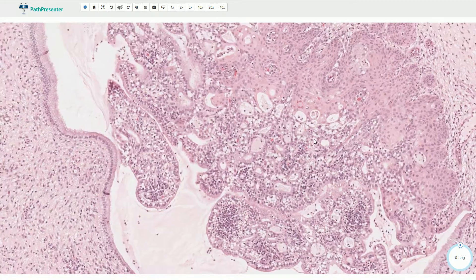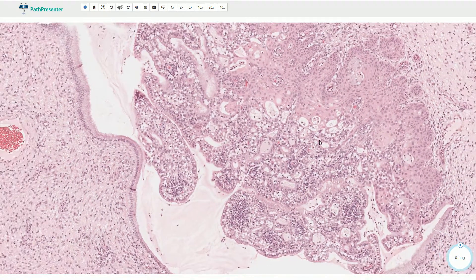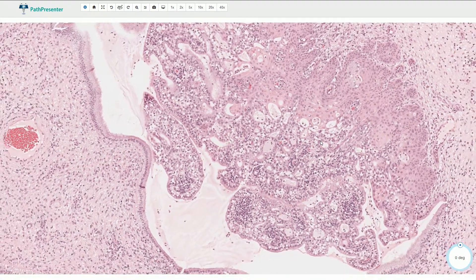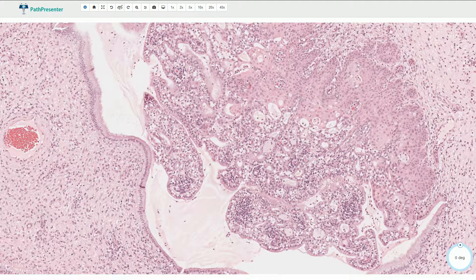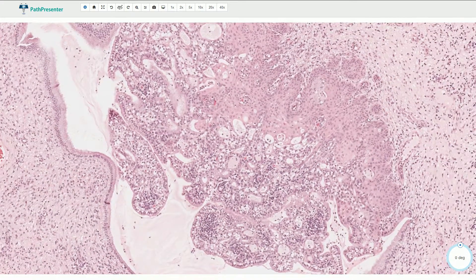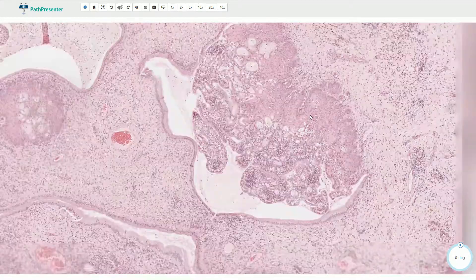This is not adenocarcinoma. This is just micro glandular hyperplasia. And here we see the metaplasia and transformation from the non-keratinized stratified squamous epithelium to the endocervical epithelium.